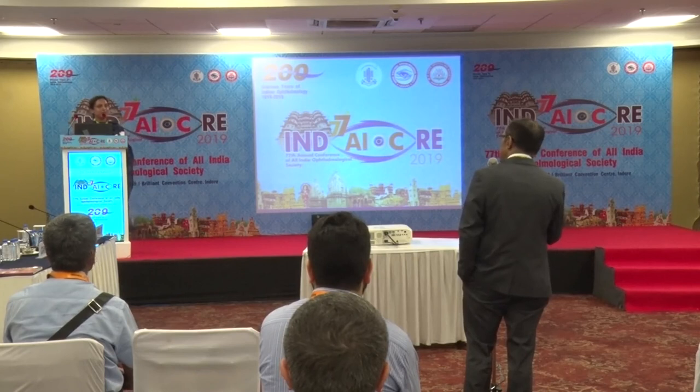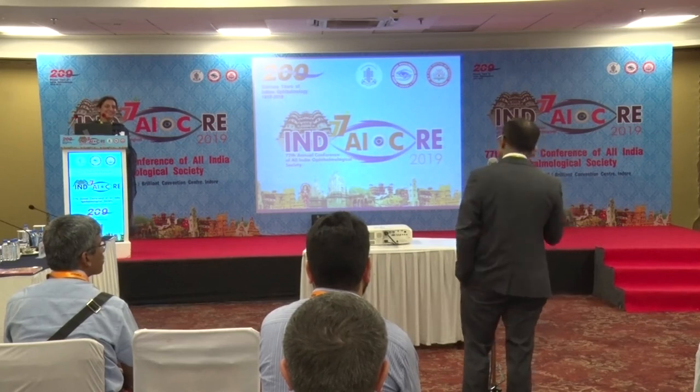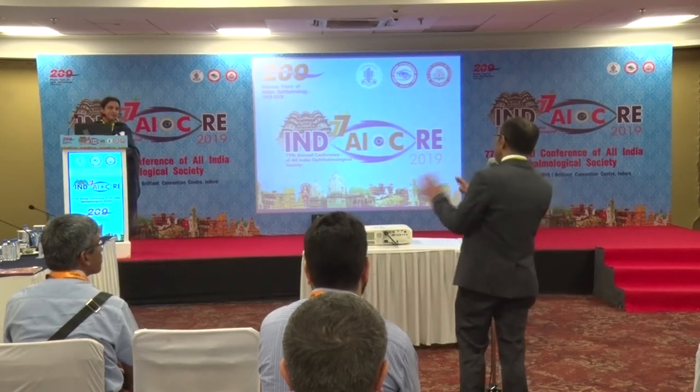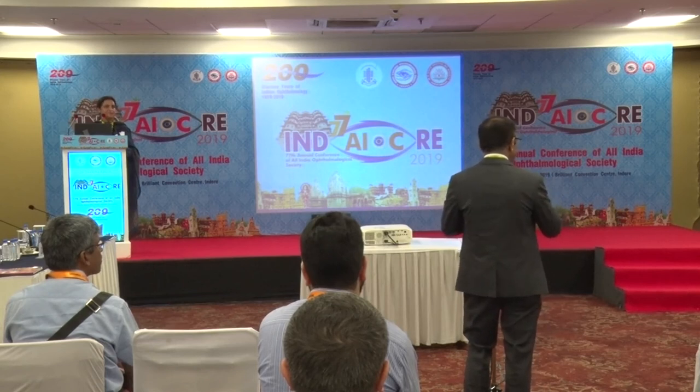The reason is that I did not get a GRT for the last one year. And last month I had three GRTs in a row. So I put a buckle in all those patients. It worked very well. And then I put oil. In spite of putting a buckle, the edge of the tear falls nicely on the buckle. So everything's fine. But even after putting oil, there's a slight slippage. There's a slight roll back of the retina.